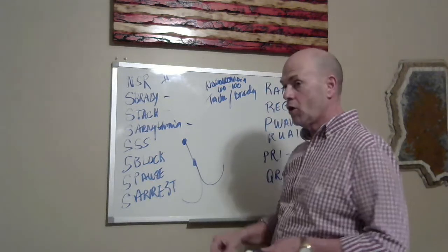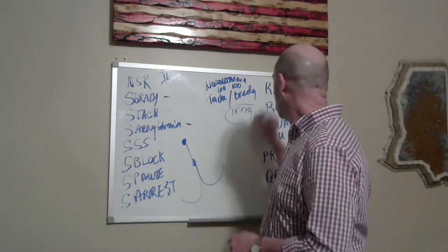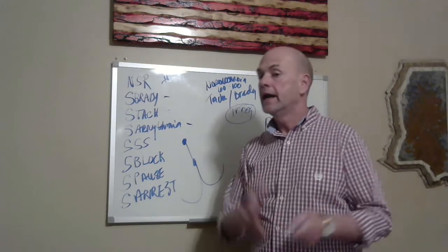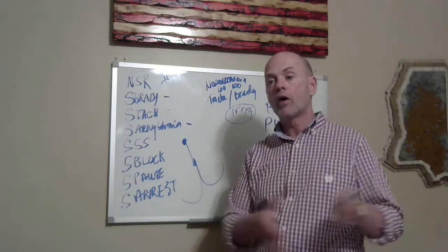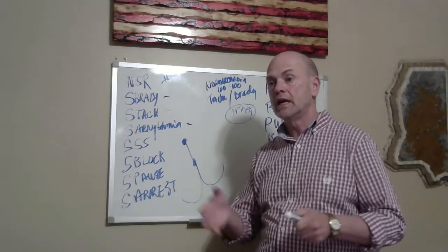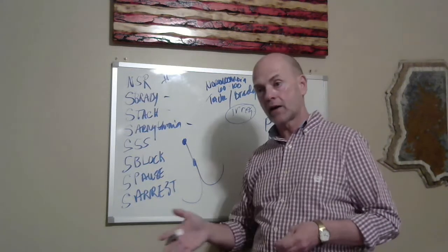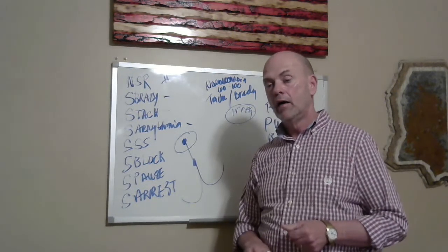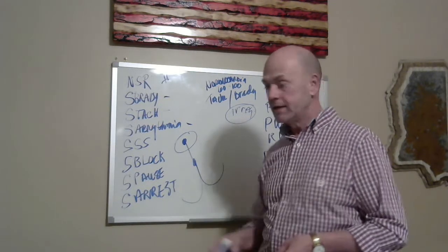So a sick sinus syndrome is going to be irregular in that it moves from normal cardia, bradycardia, tachycardia. And it doesn't have to move in the order that I just spoke. We may see bradycardia to tachycardia to normal cardia, or vice versa. You could see changes where we move from brady to normal, and then back to brady, and then to tachycardia. It's a sick sinus syndrome because the SA node is failing to maintain a normal patterned rate.